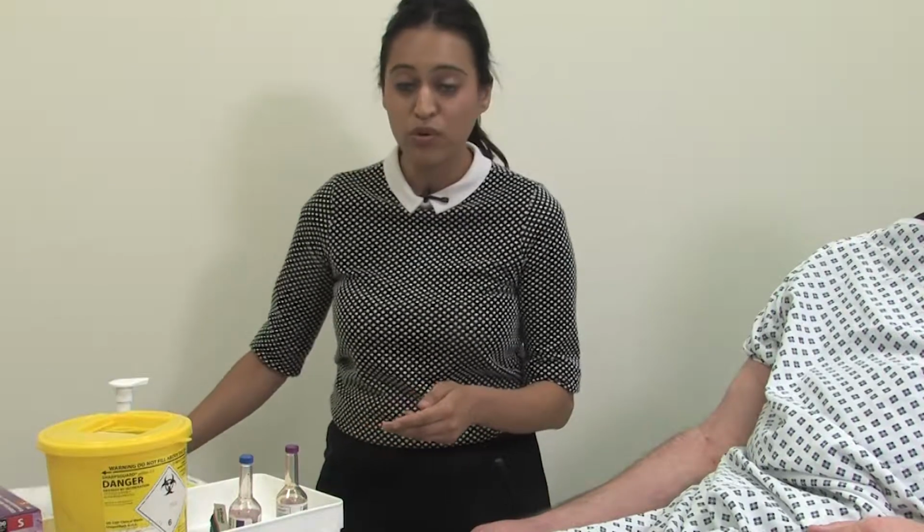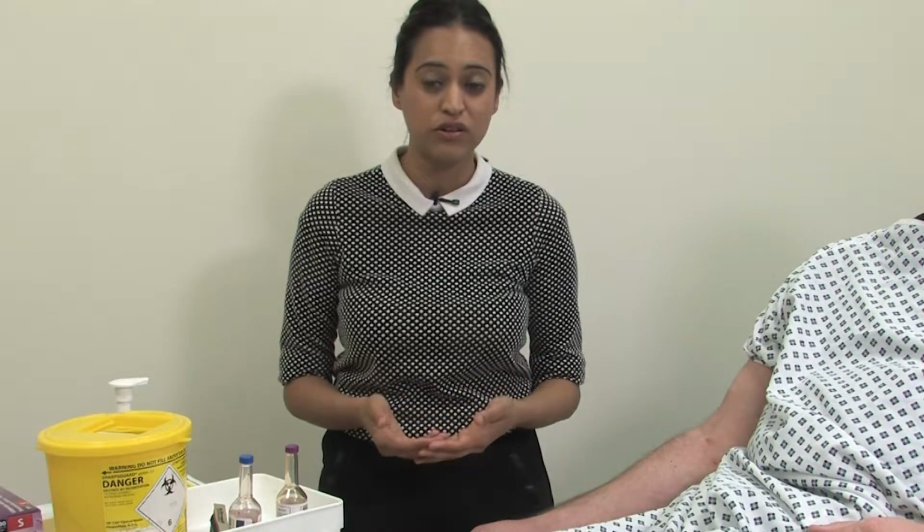Once this is done, it's important that we also document in the patient's notes that blood cultures were taken, the date and time that they were taken, and whom they were taken by.